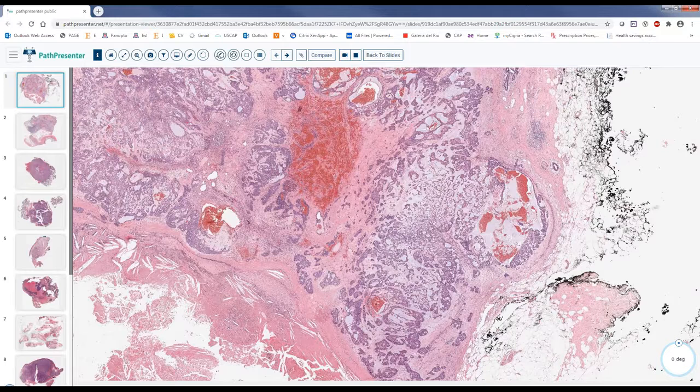Basically, salivary gland tumors have kind of similar components. It's just the arrangement that is different. If you go to the acinic cell or the adenoid cystic, you'll find some similarities in the immunostain because the components are similar. Okay, myoepithelial cells, some ductal cells, some stromal cells. So the architecture is more important.